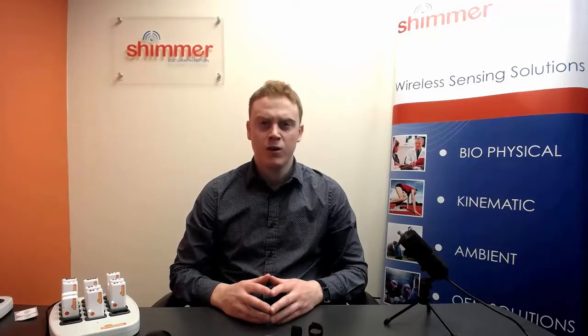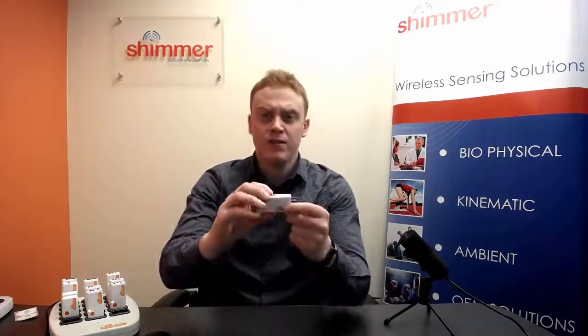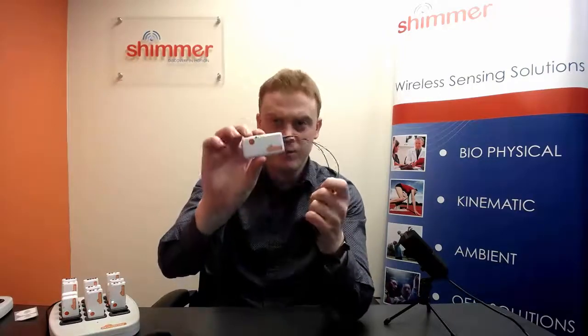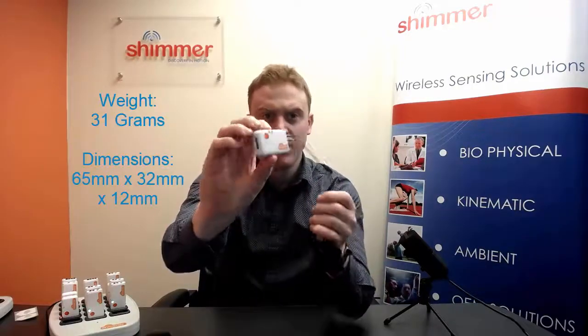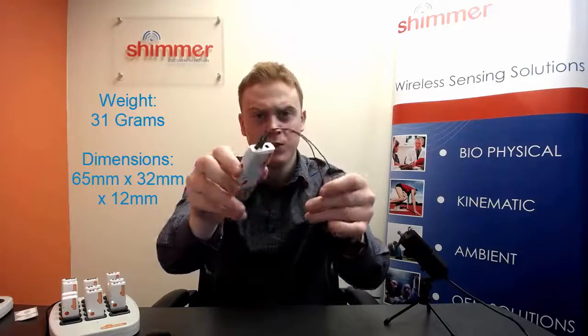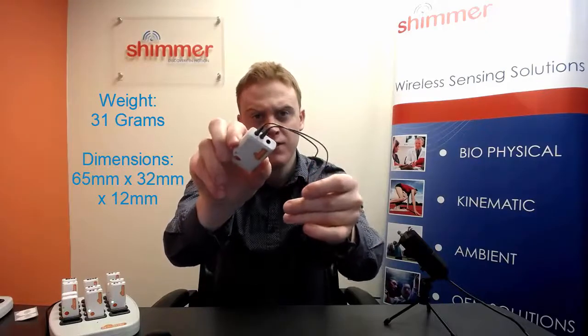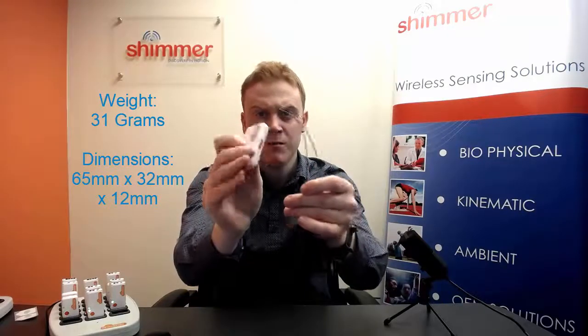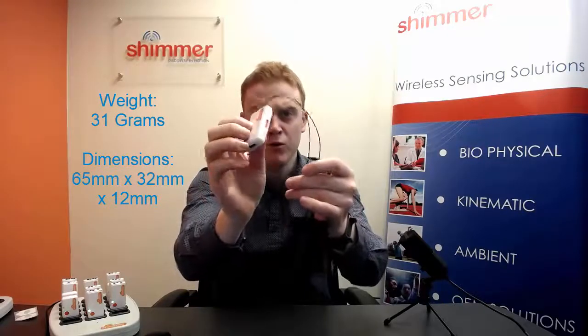Firstly, let's introduce the hardware required to collect data. Beginning with the sensor. As you can see, the Shimmer3 GSR Plus sensor is quite lightweight, weighing just 31 grams with dimensions of 65mm x 32 x 12.